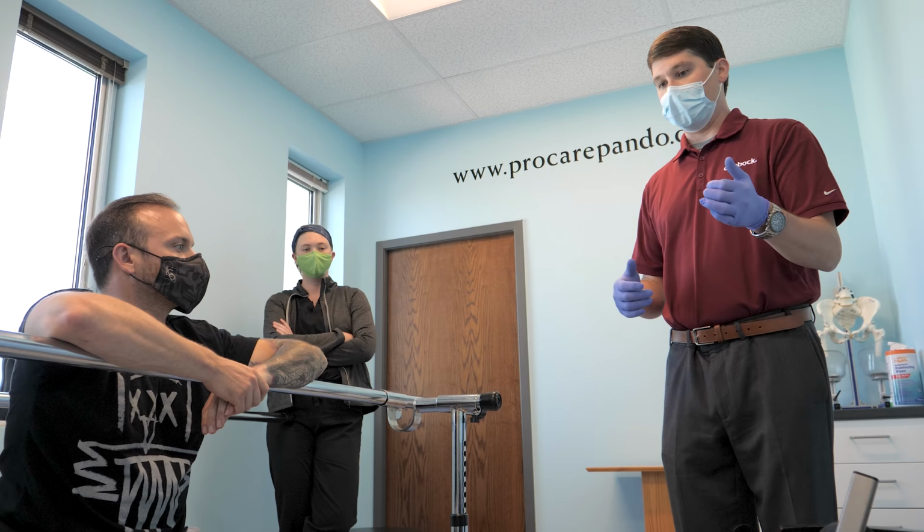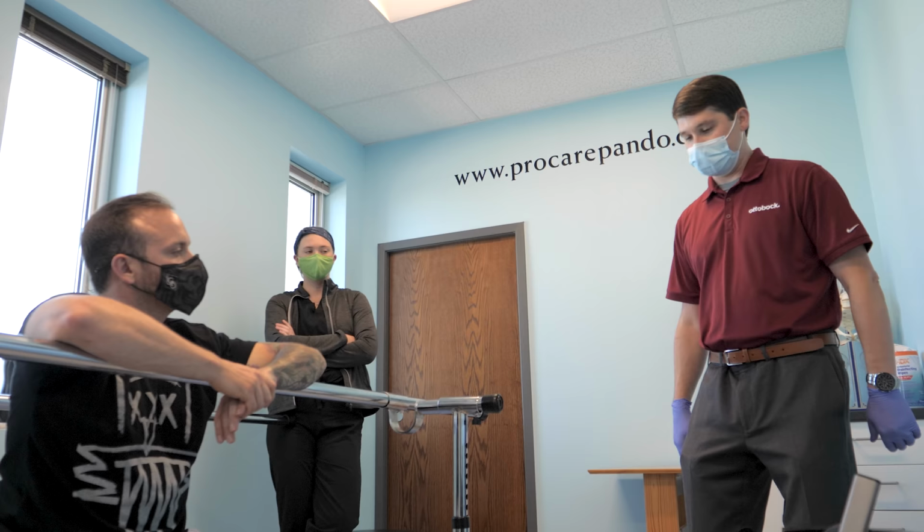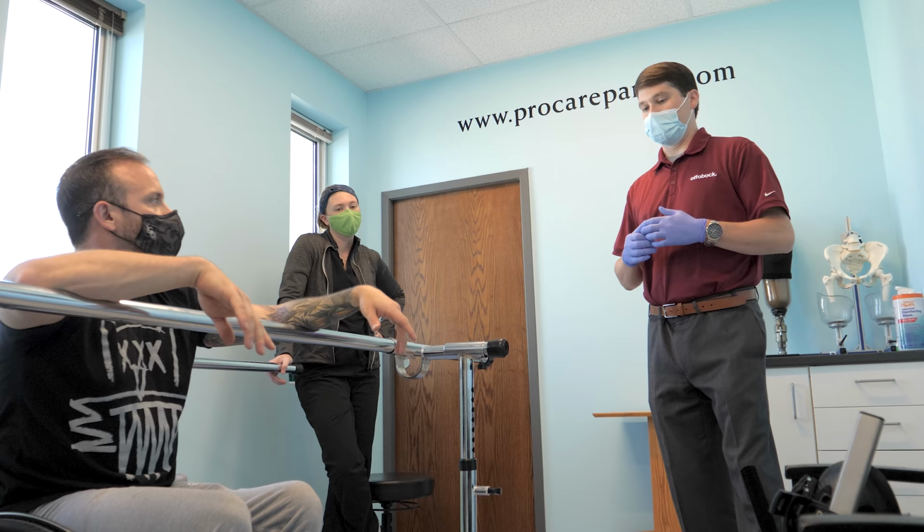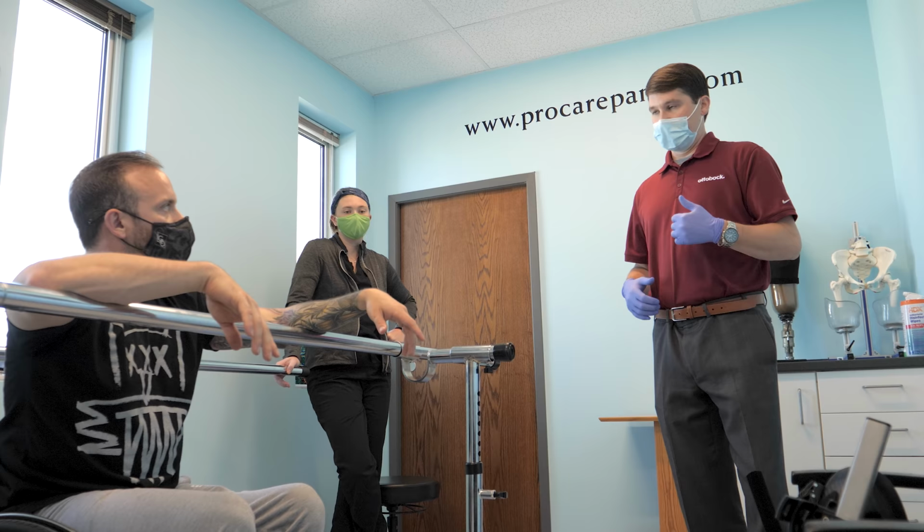Now, if you do sit on the brace like this, you can't sink into it. If you're able to keep yourself up and hold yourself at 2 degrees for 3 seconds, it'll lock. There are a few main things we're looking for when we look for a candidate: cognitive ability. Can you understand commands? Do you have some upper body? Can you advance the limb? Can you get to full extension?